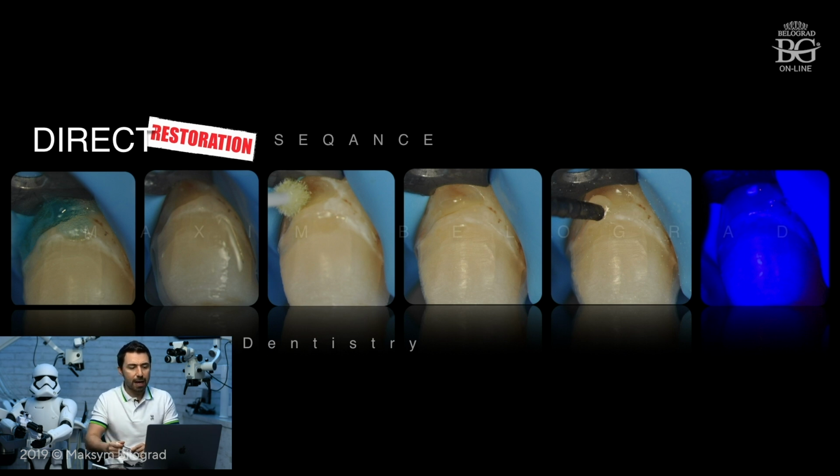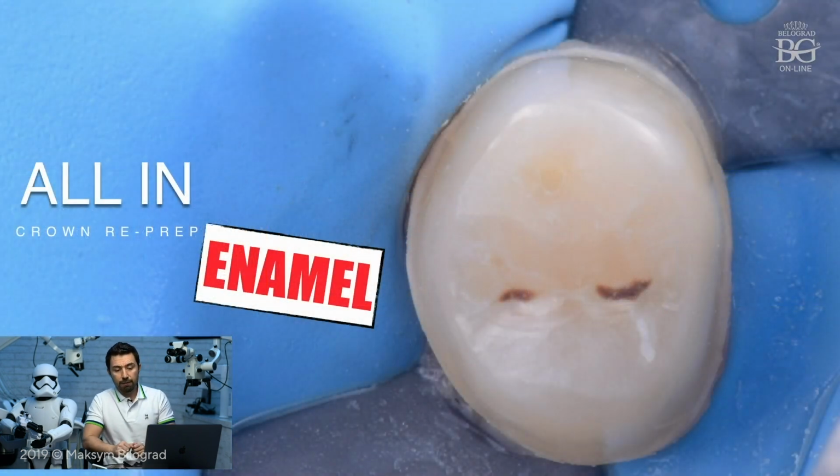These are the steps of the sequence of the direct composite restoration. In that case, I used the total etch technique, so I etch dentine, I etch some enamel, then I bond, then I place some flowable, then I make some packable composite layering, finishing, polishing, and this is the result. You can see all enamel around preserved, a pretty thin preparation.